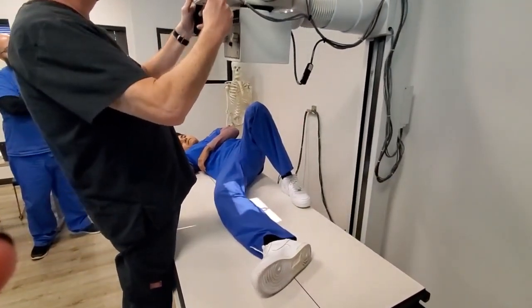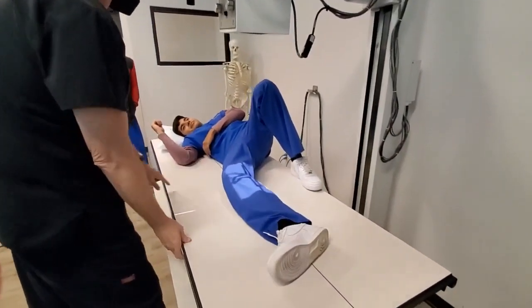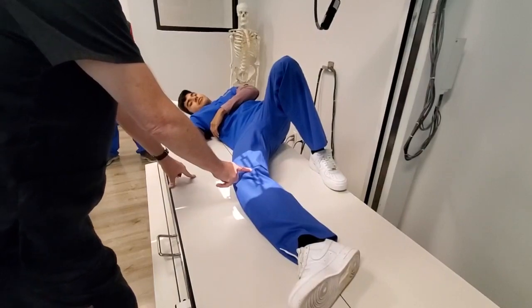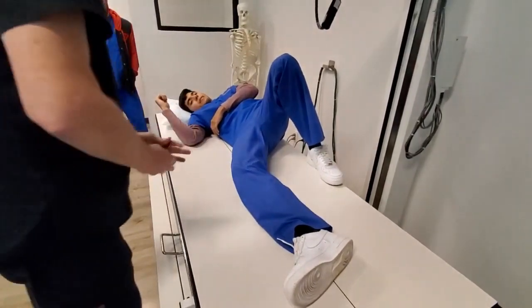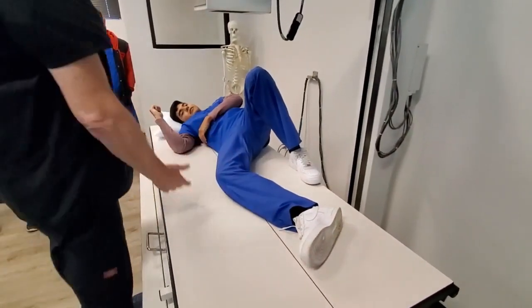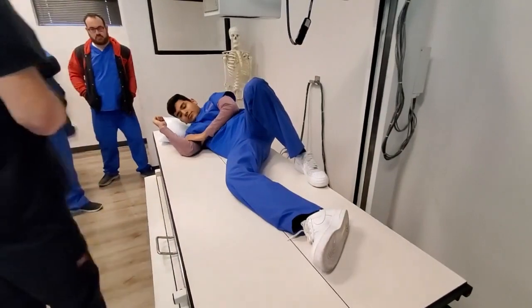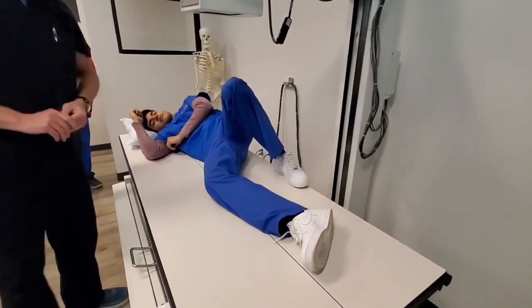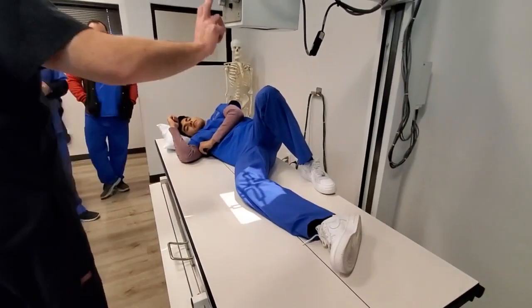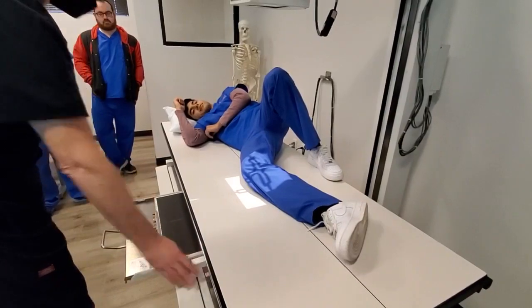Central ray needs to be at the medial epicondyle — one inch. How much do we want the leg flexed? 20 to 30 degrees. Bend your knee a little bit more. I'm going to have you rotate your hips a little bit more towards me. How do we want the epicondyles in this projection? Superimposed. Remember: when we add the angle, we need to recenter the IR and the CR. Now we're centered — five degrees cephalic angle.